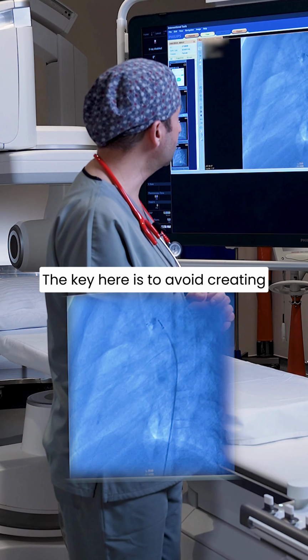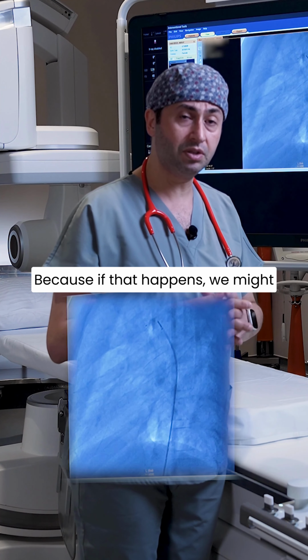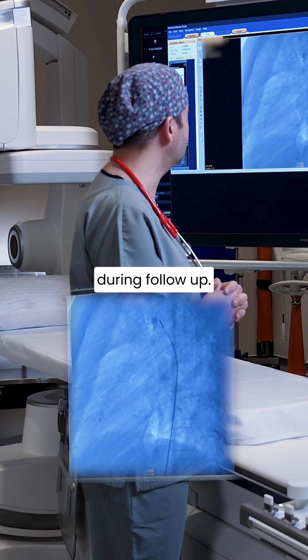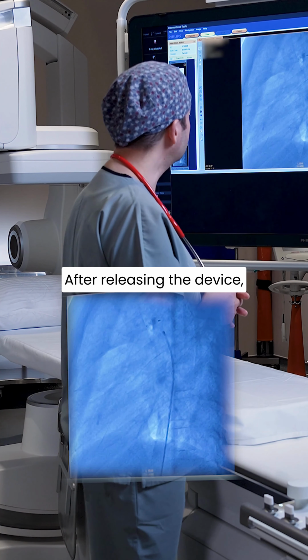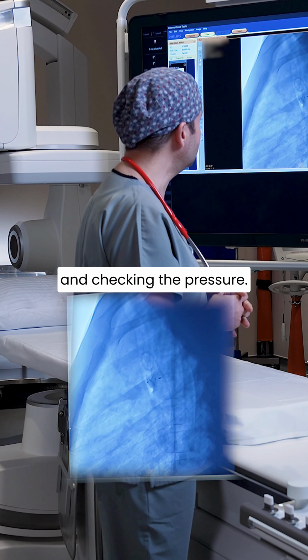The key here is to avoid creating any narrowing in the aorta or the pulmonary artery, because if that happens, we might need to remove the device or perform a balloon procedure during follow-up. After confirming everything was correct via both angio and echocardiography, we released the device as you see here. After releasing the device, we conclude the procedure by performing an injection and checking the pressure.